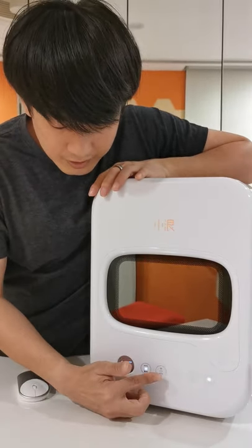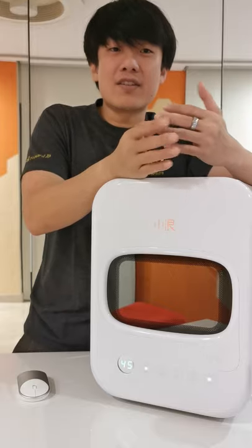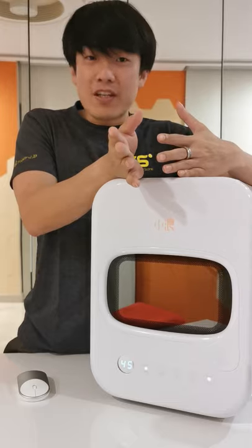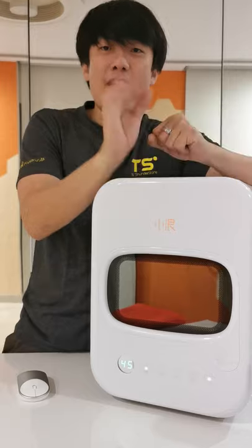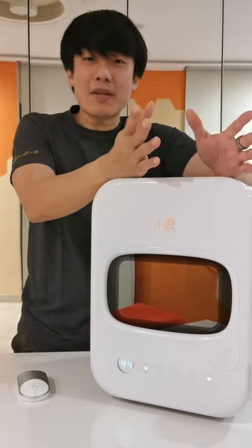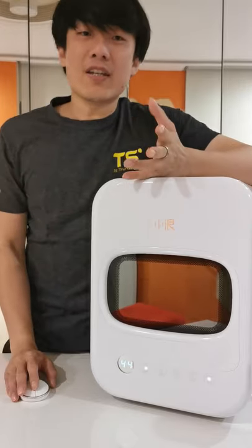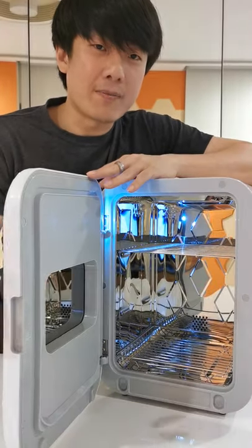So the UV mode is similar. What happens in the UV mode? During the UV mode process, it will blink 5 seconds again to confirm your selection. This UV has 3 different modes: a 7 minutes mode, a 12 minutes mode, and a 17 minutes mode. For the 7 minutes mode, it will provide you with 5 minutes of UV and then 2 minutes of ventilation. For the 12 minutes mode, it will provide you with 10 minutes of UV followed by 2 minutes of ventilation, etc. During the UV process, you will still be able to operate the doors to place in more items.